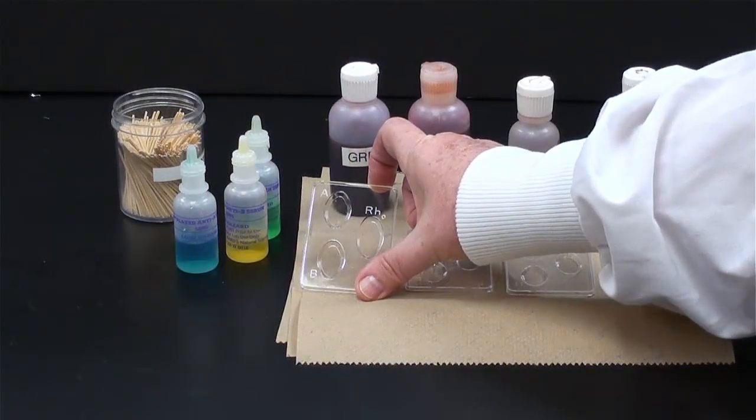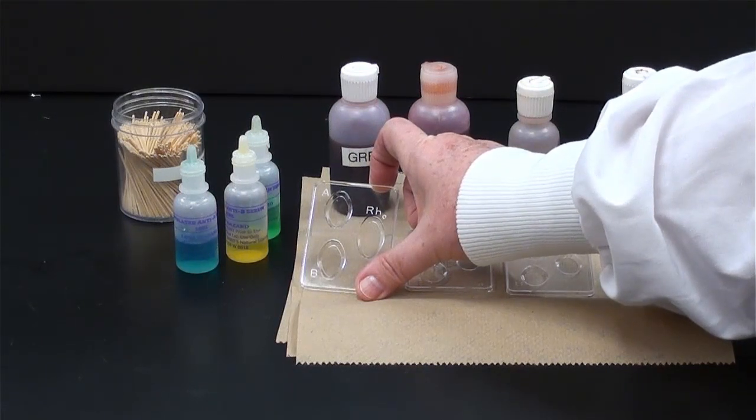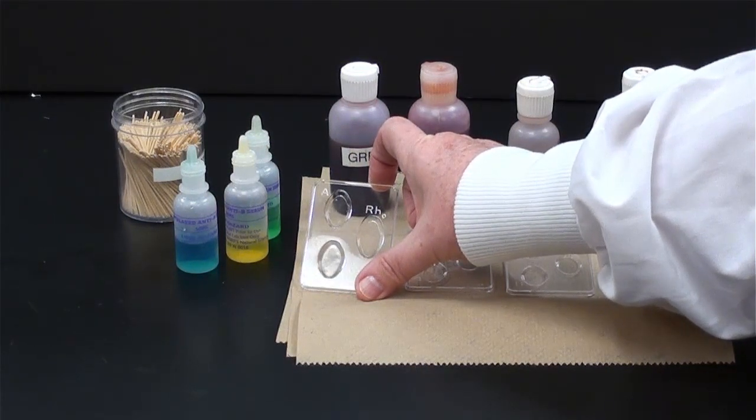Each of these little trays has three depressions or wells, one marked A, one marked B, one marked RH.